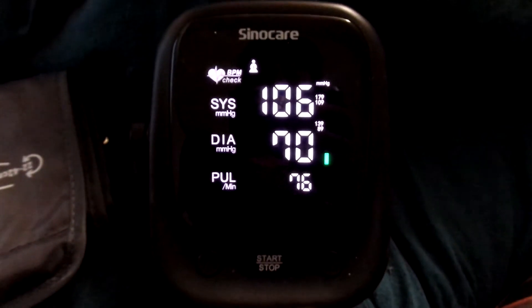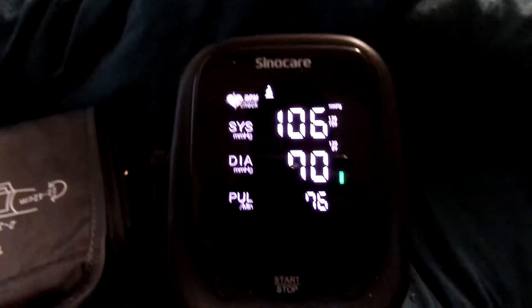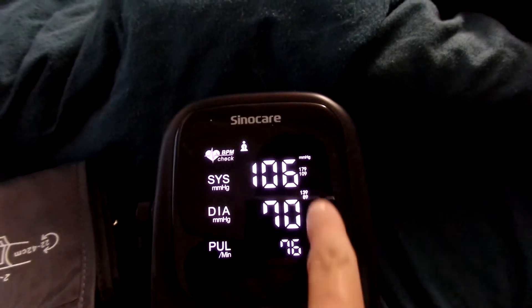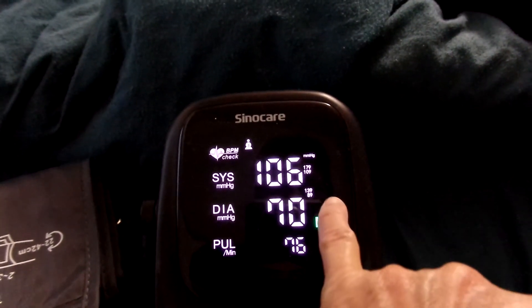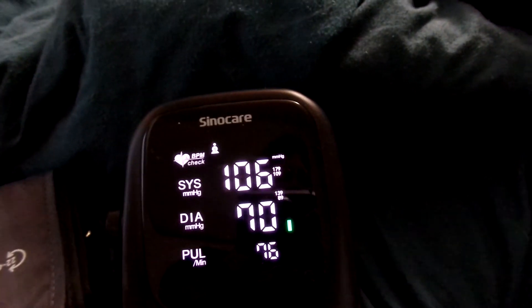It's got a nice big screen — it's easy to see, easy to read. It tells you everything on the screen. It's got a little indicator that shows you whether your reading is good, with yellow and then red to show you how your blood pressure is.